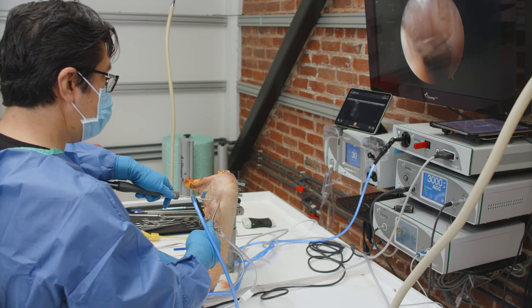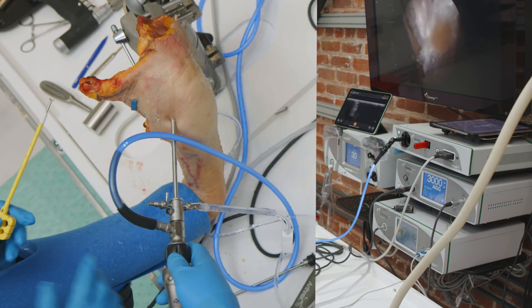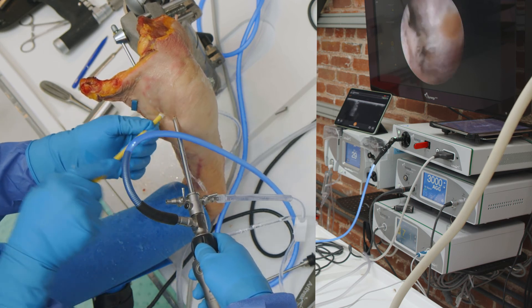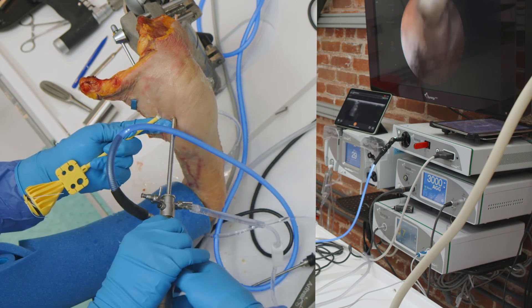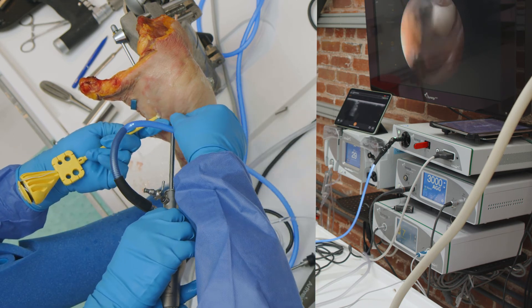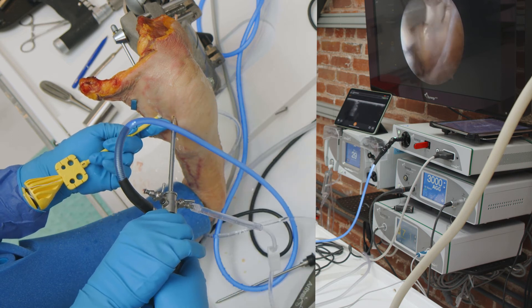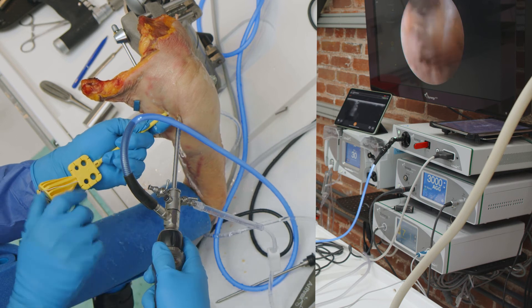What we can do for the tenodesis is move the tendon over to the side, then go ahead and make our hole. Basically we're just going to take our forked swivel lock in here. See it right there? Once I have that, I've grabbed my tissue and forced it into the hole.